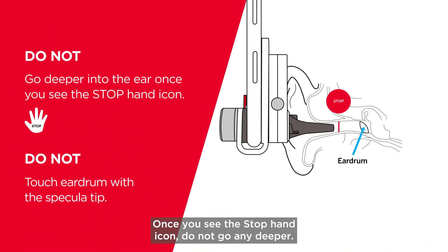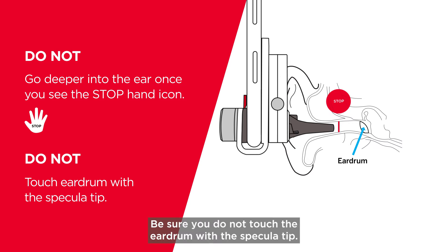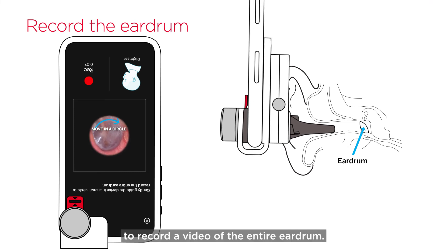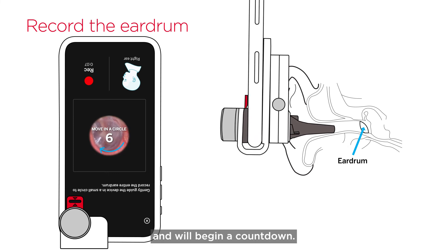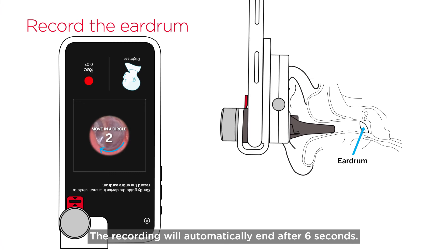Once you see the stop hand icon, do not go any deeper. The eardrum has been found. Be sure you do not touch the eardrum with the specula tip. Gently move the specula tip in a circular motion to record a video of the entire eardrum. The app should recognize when the eardrum has been found and will begin a countdown. The recording will automatically end after six seconds.